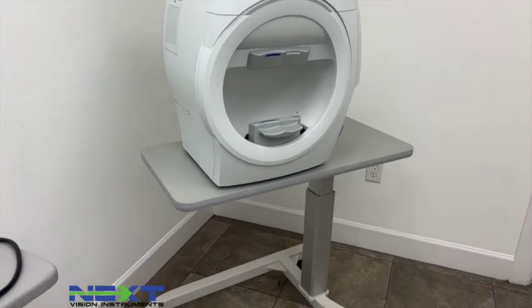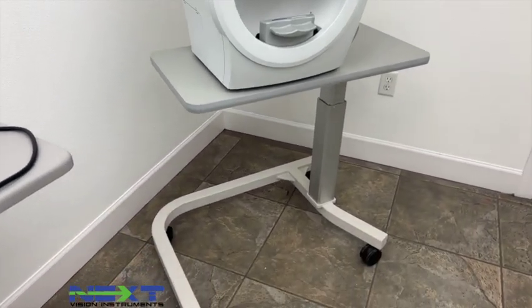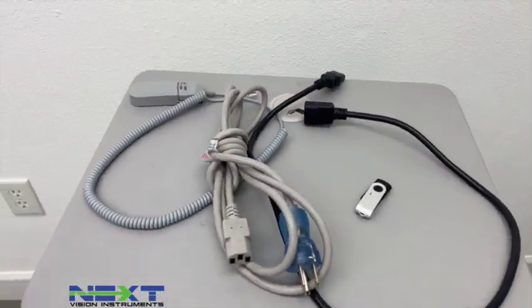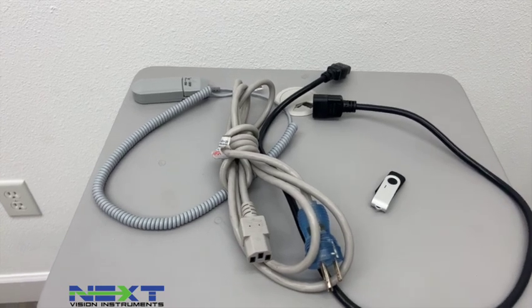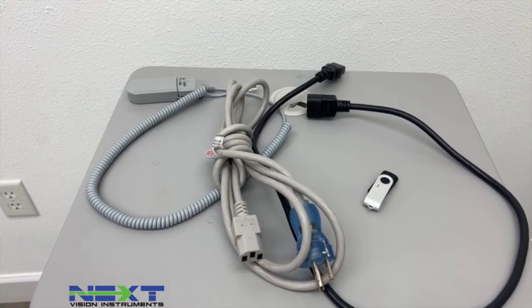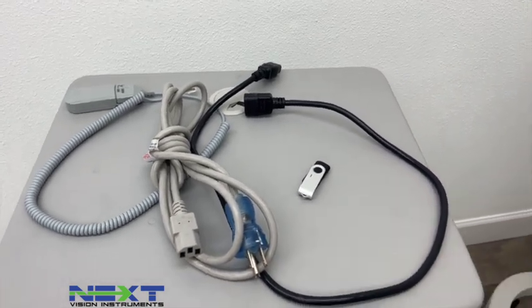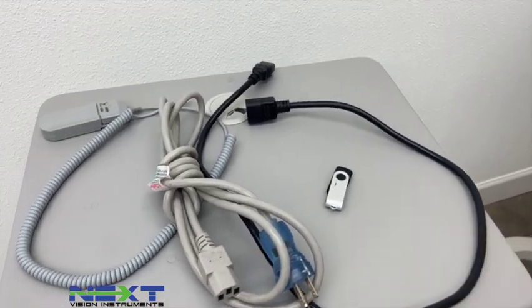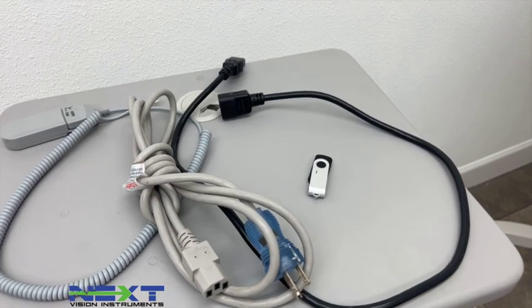When you purchase an HFA 3 from NexVision it will come with the table, the unit itself, and accessories. There is the patient response button, the power cord, the black cord from the unit to the table, and a flash drive which has the user's manual on it.